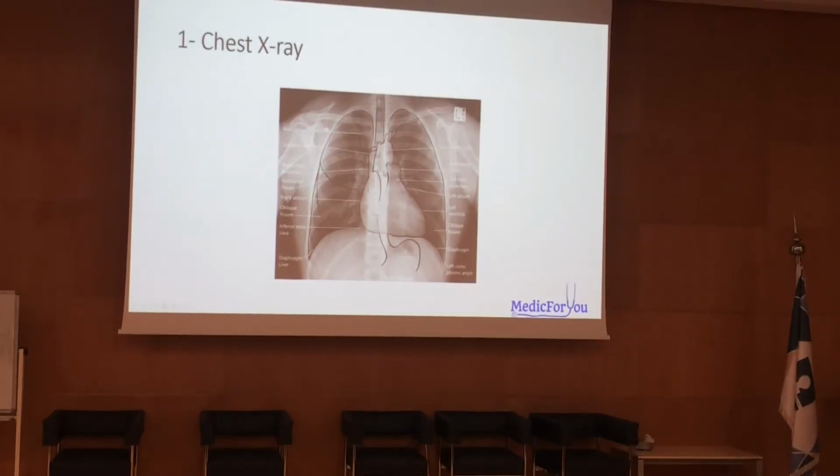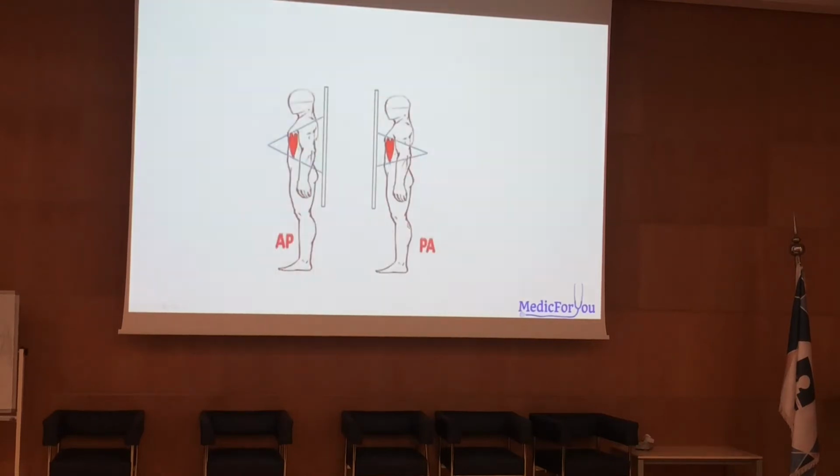And importantly, know the pulmonary trunk and the aorta. So the aortic arch comes this way, and the pulmonary trunk. These are very important findings in cardiology. The other thing is to know the size of the heart and to make sure if there is any cardiomegaly or not. And I'm going to show you some pictures.